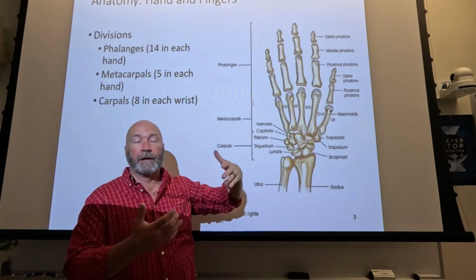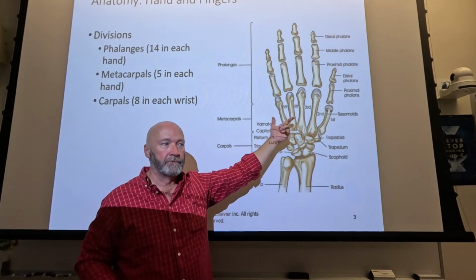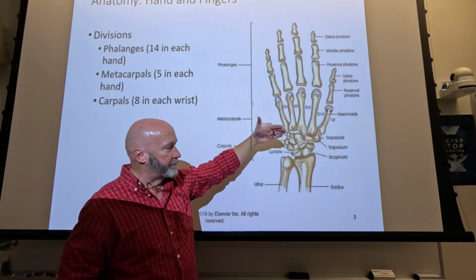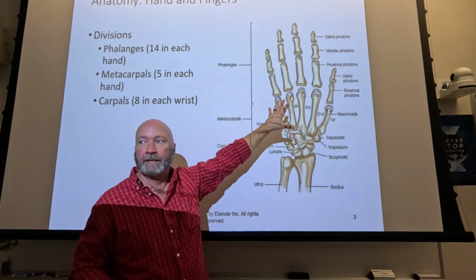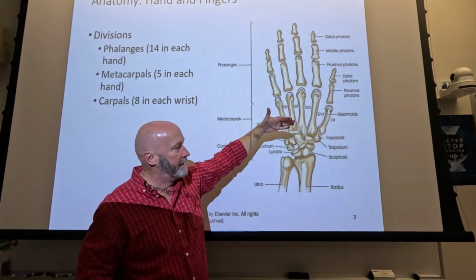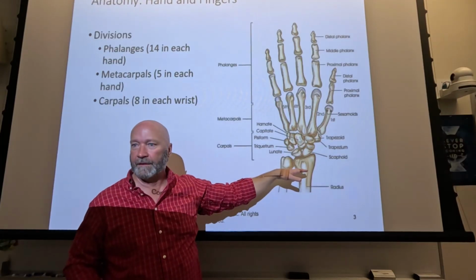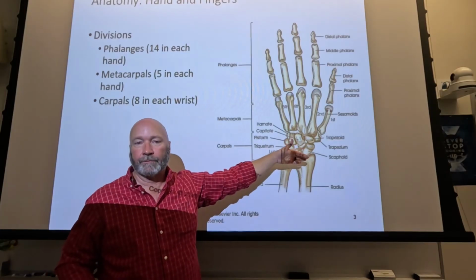So your collimation should be open up enough so that you can see beyond the skin line by about a ½ inch. And the structure shown included on the anatomy is all the anatomy that you should need for the exam, for this example, hand and the wrist bones, but you also need to include about a third of the radius and ulna, or at least a distal end of the radius and ulna.